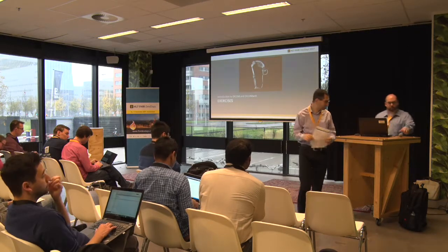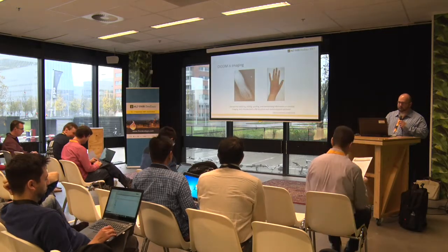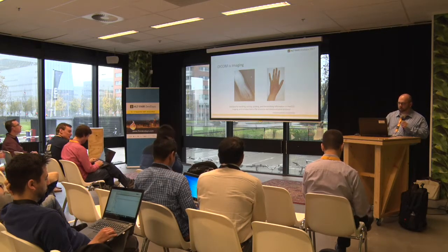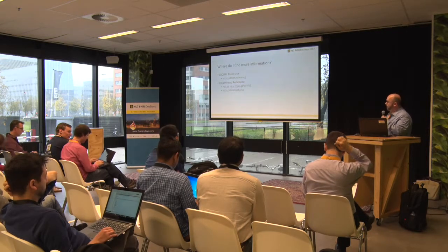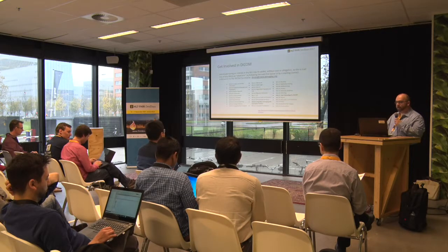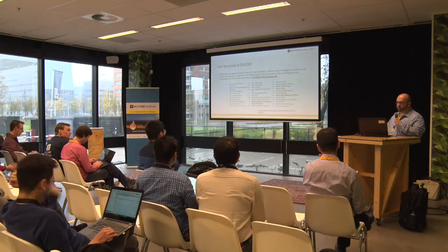Yeah, so just to wrap it up really quick, and then maybe we have time for one or two questions. So we went through the exercises. So conclusions: DICOM is the standard for handling, storing, printing, and transmitting information in medical imaging, with a file structure and communication protocol. If you want to find out more information, you go to dicom.nema.org. And I also maintain a website, dicomweb.org, where I've got cheat sheets and things like this. I recommend, if you're very interested, get involved in DICOM, as just like with HL7, it's free to join. You get on the mailing list, get information about it.